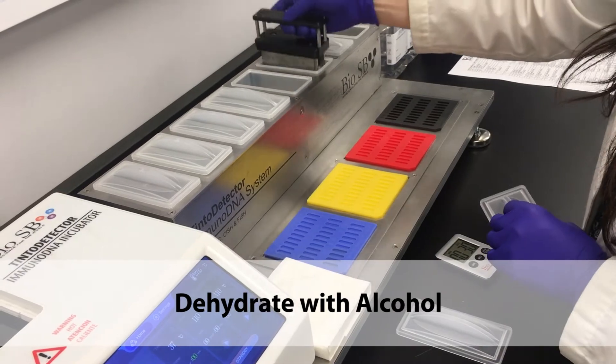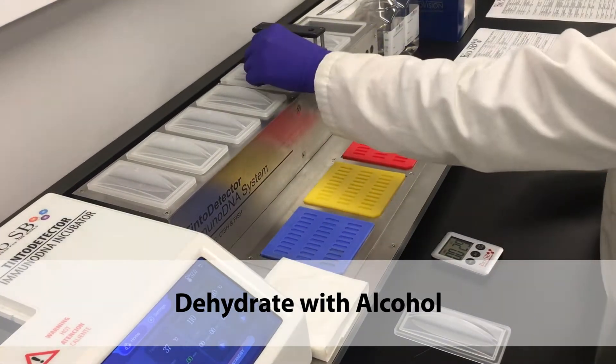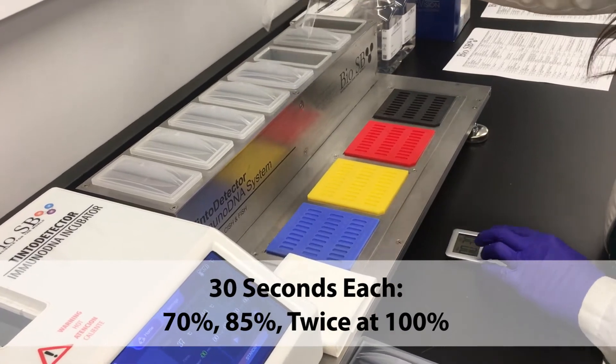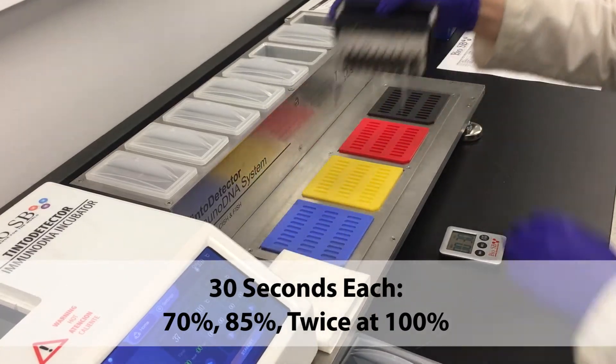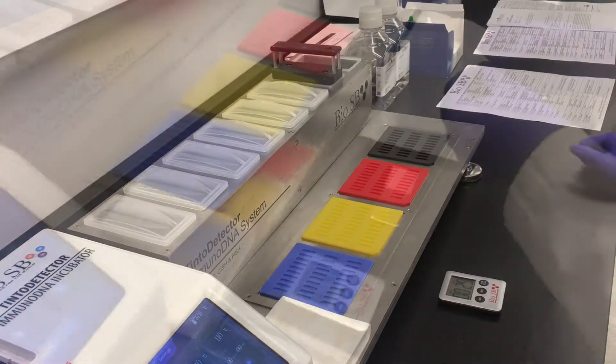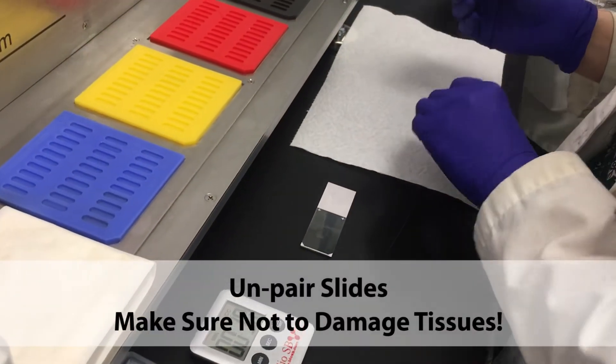Dehydrate with alcohol for 30 seconds each at 70%, 85%, and twice at 100%. Unpair the slides, being sure not to damage the tissues.